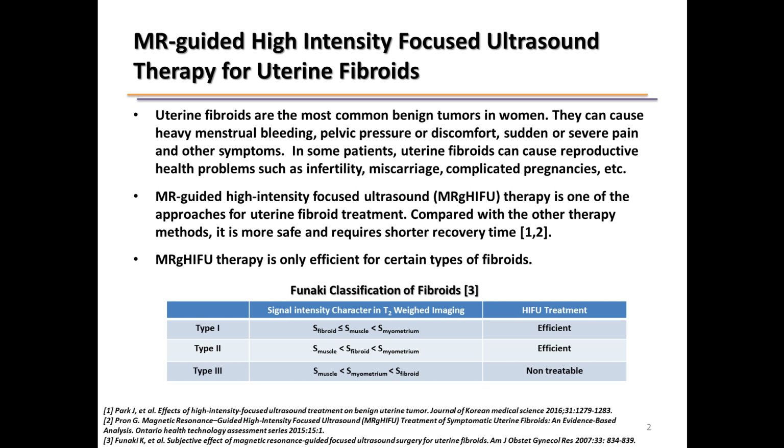ultrasound treatment. MR-guided HIFU is a therapy method using real-time MR imaging to monitor the elevation of temperature at the HIFU focus during ablation. It's safer and requires shorter recovery time compared with the other therapy approaches. However, it is not efficient for all fibroids.